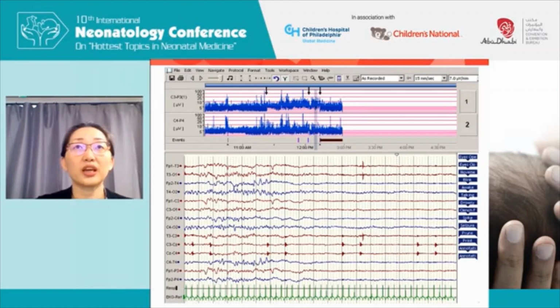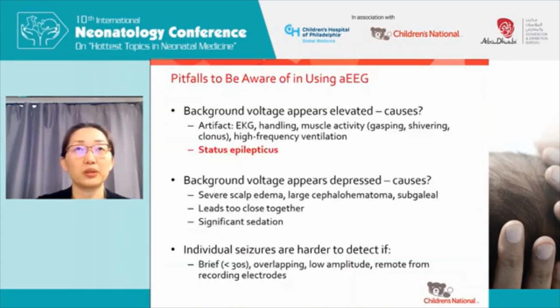And then with recannulation, you see there's almost immediate resumption of the EEG background to pre-ECMO levels, so that no matter how clinically concerning the patient may have looked or was behaving during this period before they went on ECMO, it wasn't sustained enough to have a significant impact on electrical function, therefore brain function of the baby.